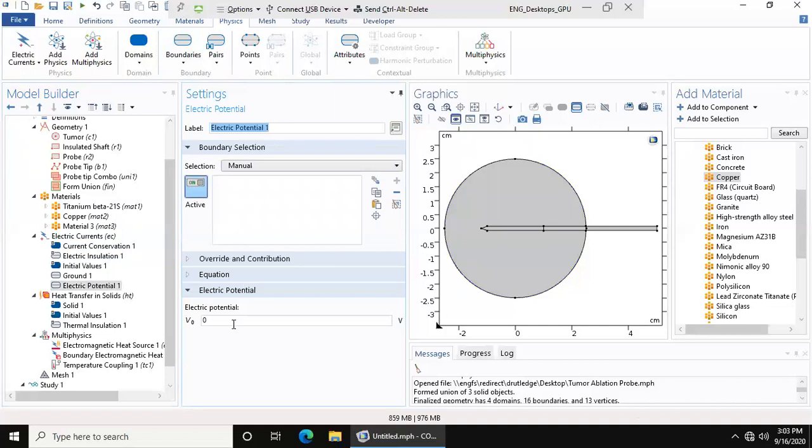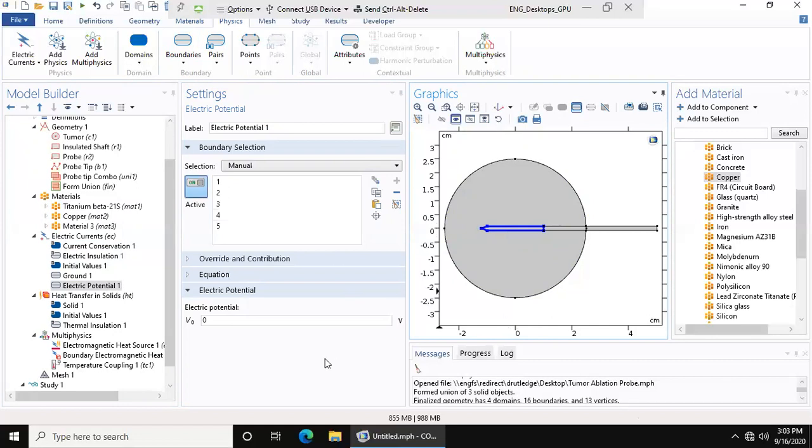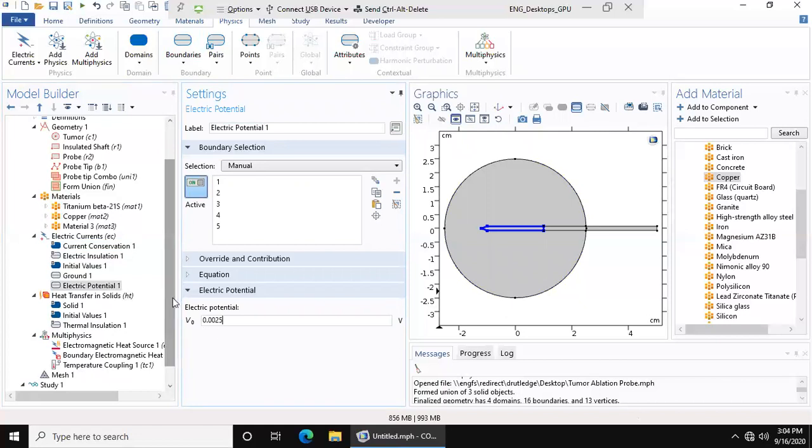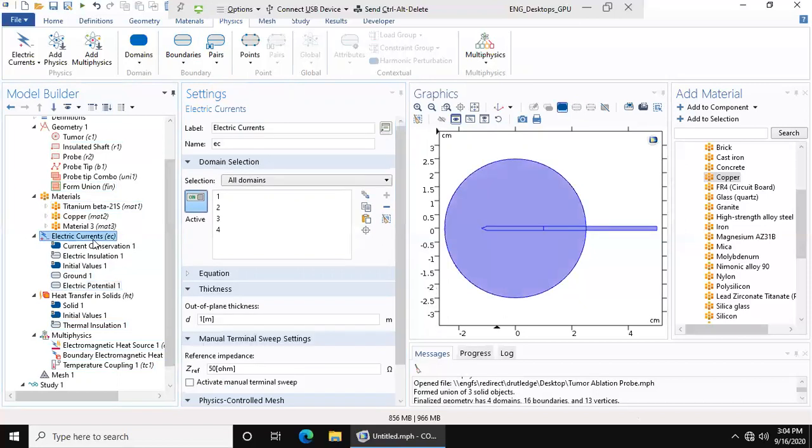Electric potential: we want our probe to have electric potential because that's the whole point of the model. Based on what I've done previously, our electric potential should be 2.5 millivolts, 0.0025. Now we have our electrical current physics set up.